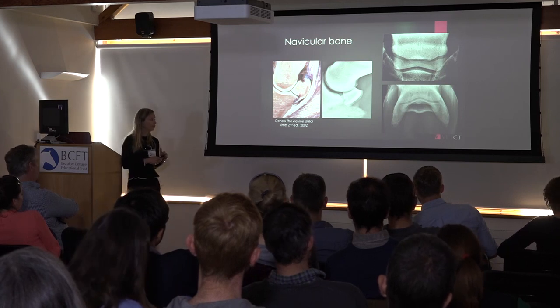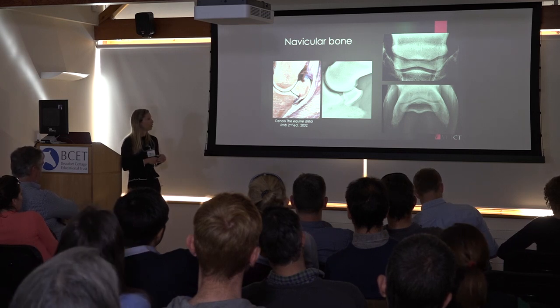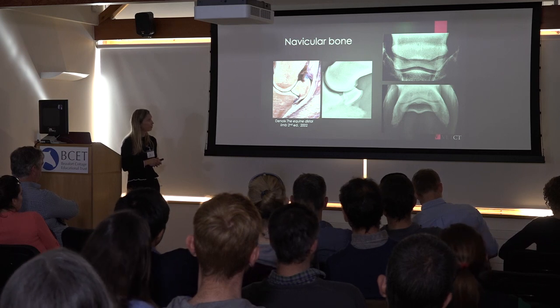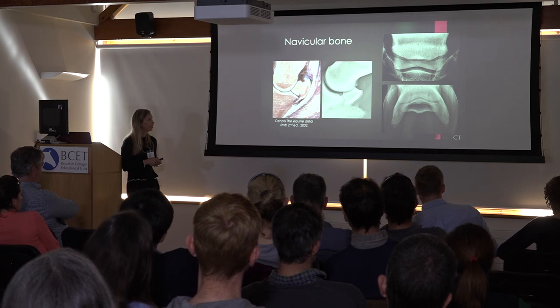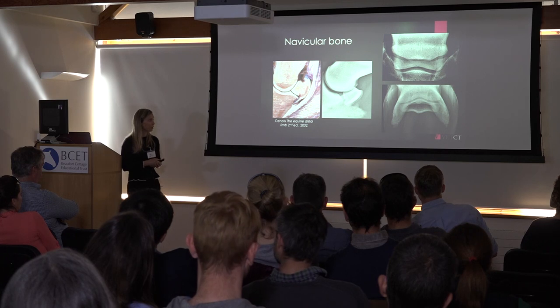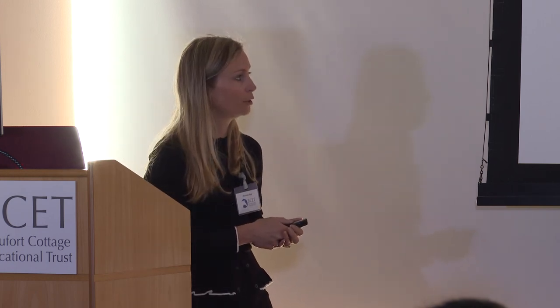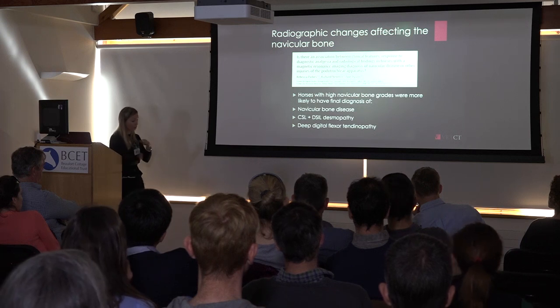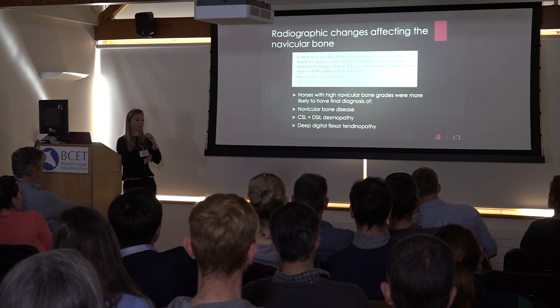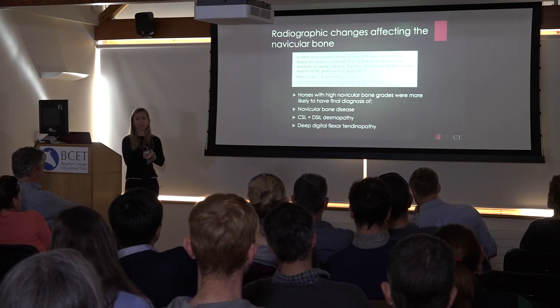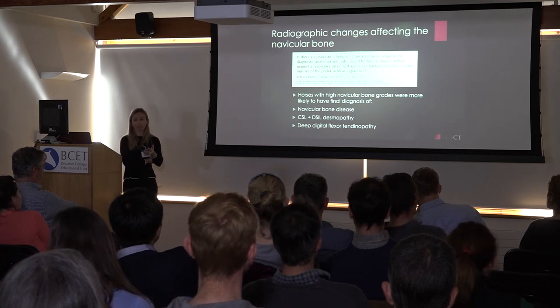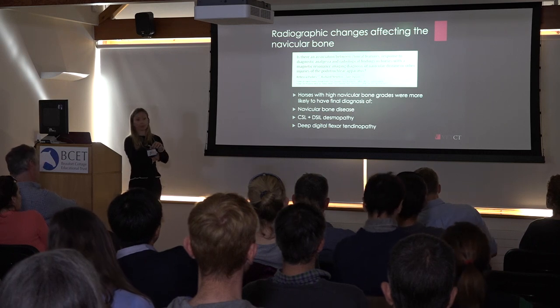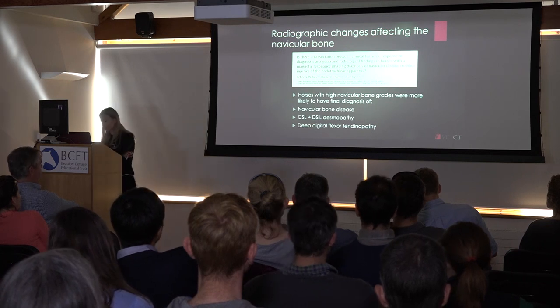The navicular bone deserves careful attention because it is in close contact with the deep digital flexor tendon, has collateral sesamoidean ligaments attaching at the proximal border, and the impar ligament at the distal border. We should look carefully at the palmar, proximal, and distal borders. Importantly, horses with high-grade navicular bone changes on radiographs are more likely to have pathology in the navicular bone itself, but also in the tendon or ligaments of the navicular bone.